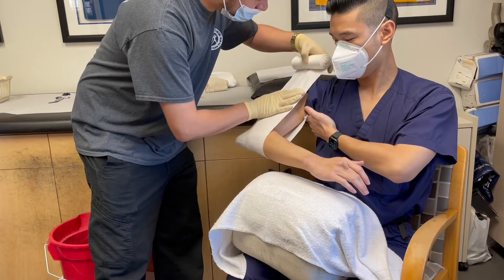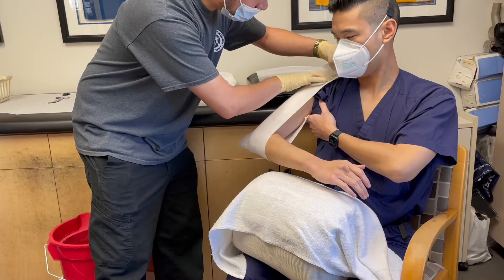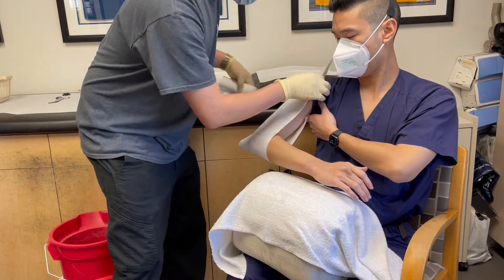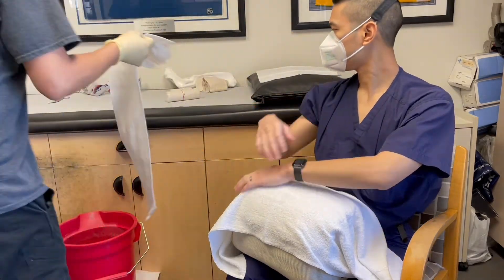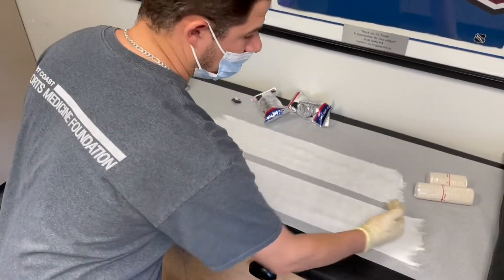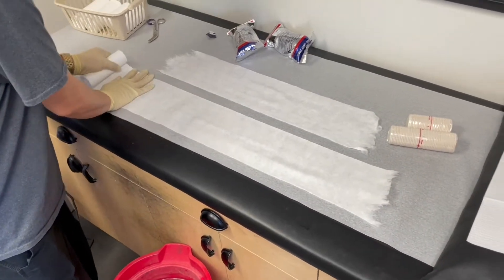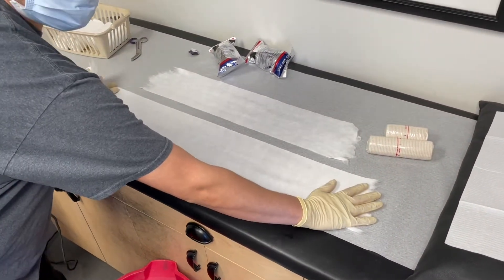We will use this padding to measure out how long the fiberglass splint should be. The padding should be longer than the fiberglass. As you can see here, when we lay down the padding, it should extend approximately a few inches past both ends of the fiberglass.